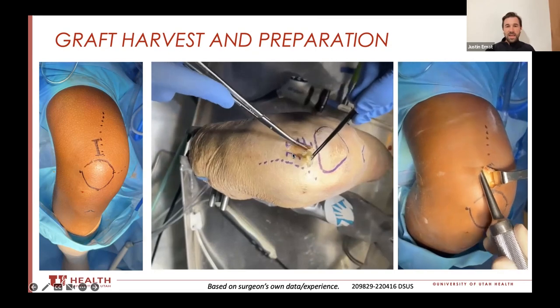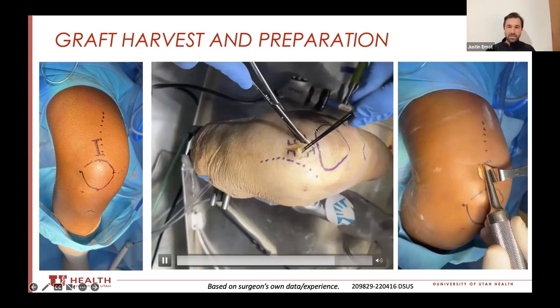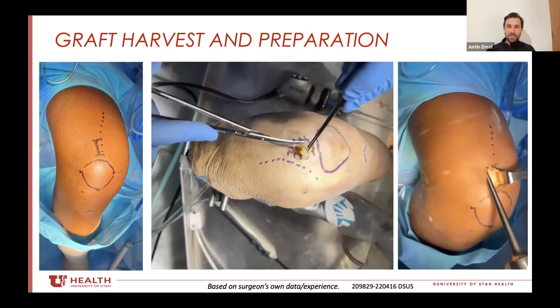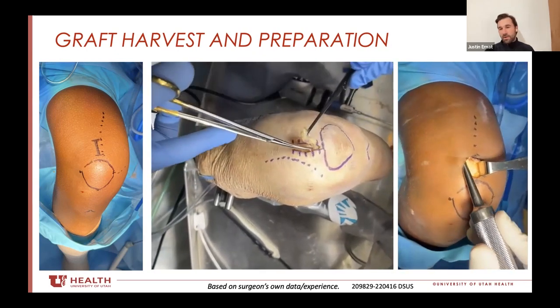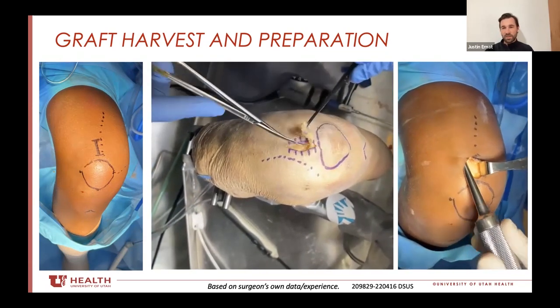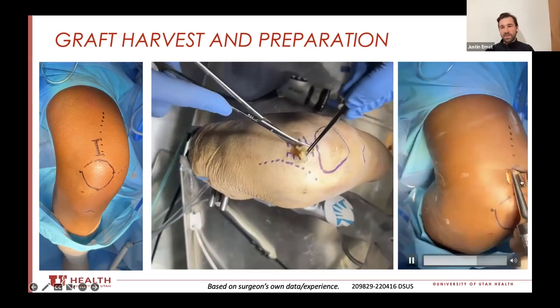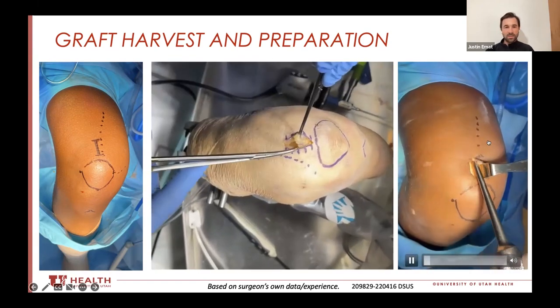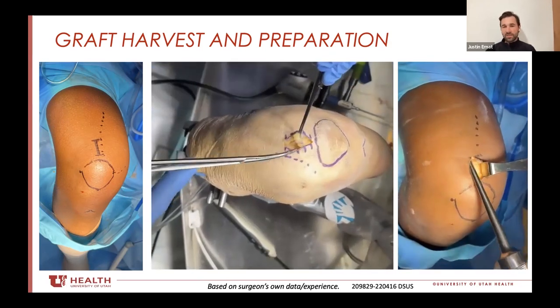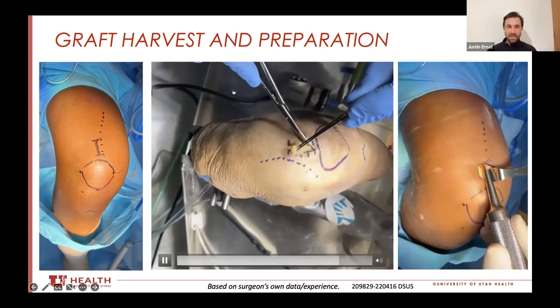I position the knee at 90 degrees and use a vertical incision. There's a little piece of fat over the tendon — I remove that and right below there is the quad tendon. I take a Cobb elevator and in line with the tendon I elevate the rest of the stuff proximally. The dotted line is the outline of the VMO muscle, so I'm constantly keeping that in mind because I don't want to damage any muscle. It's a pretty cosmetic incision — this is actually probably twice the size of what I use now.